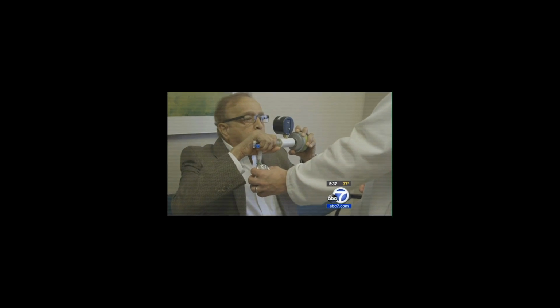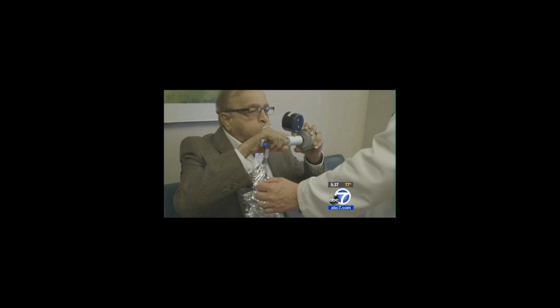Blood tests, body scans, waiting weeks for results. New technology that may detect illnesses early and easier than ever before. A breath test was able to detect severe heart failure with 100% accuracy. And not just those with high risk factors, allowing for earlier detection and the potential to save more lives.